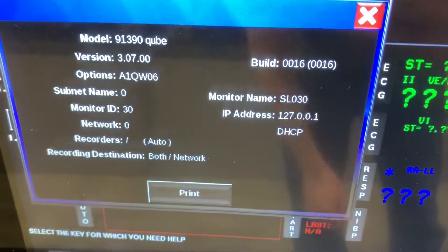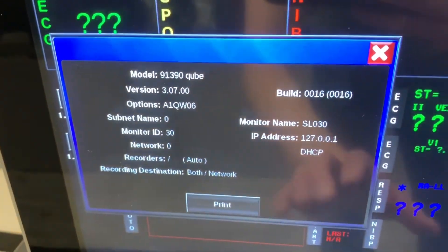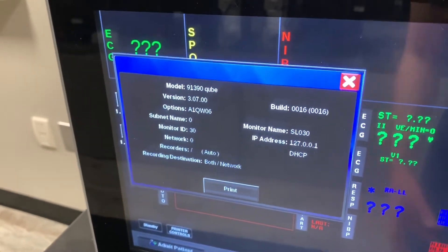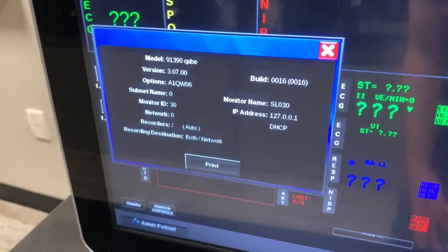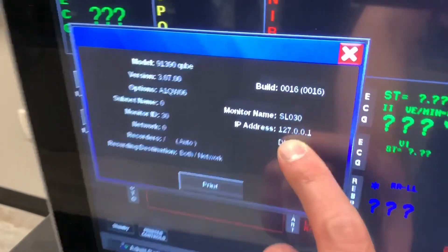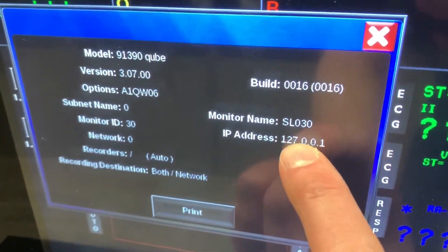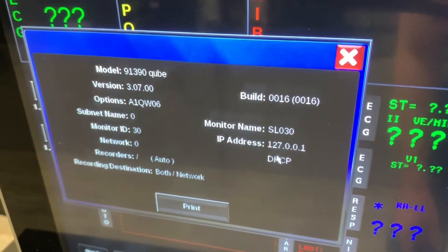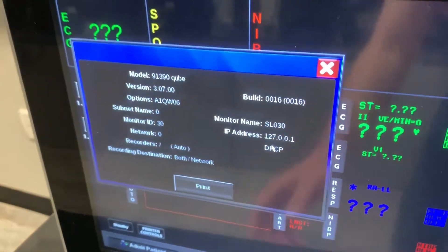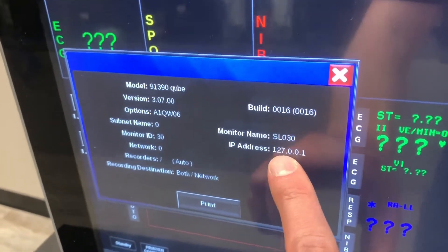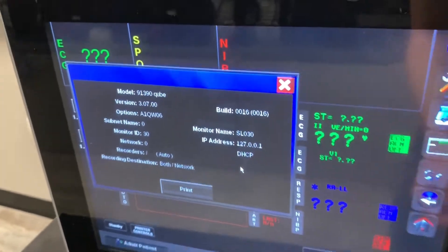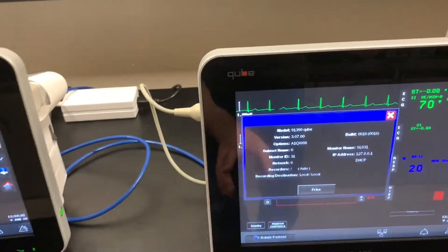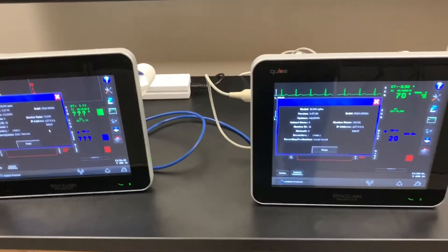So they're both trying to use DHCP. This system does not use the automatic IP addressing system that Windows and Mac would use. It's given itself this IP address, and this particular IP address is the host IP address — so this address actually resolves to itself. There's no way for it to be able to talk to this machine. What we have to do is set up the network for that.